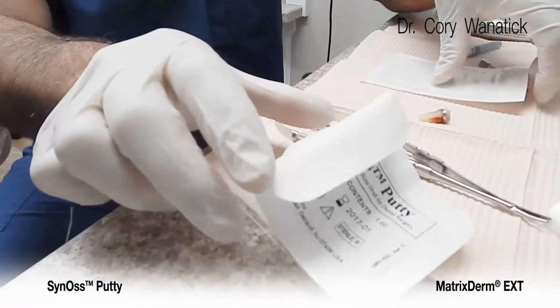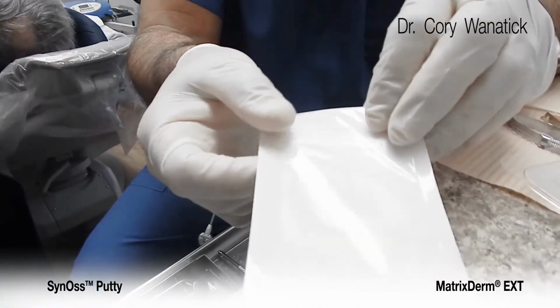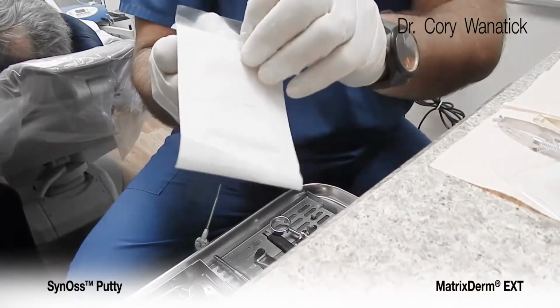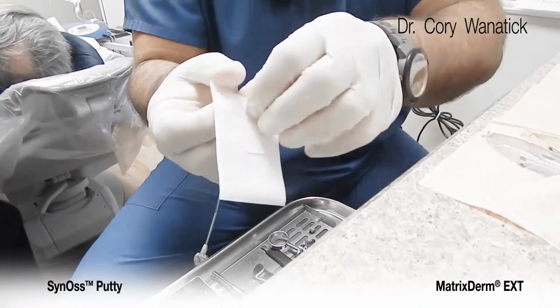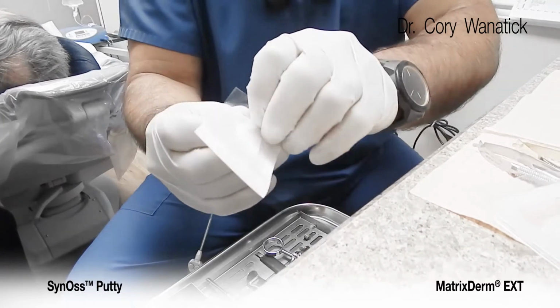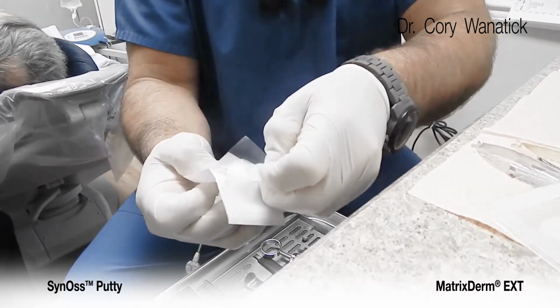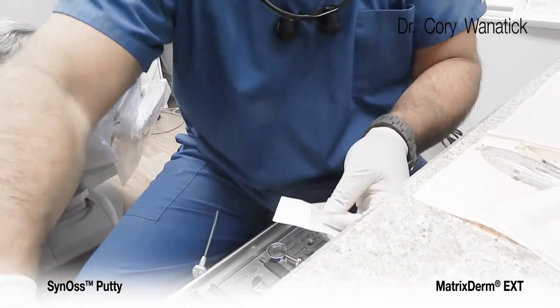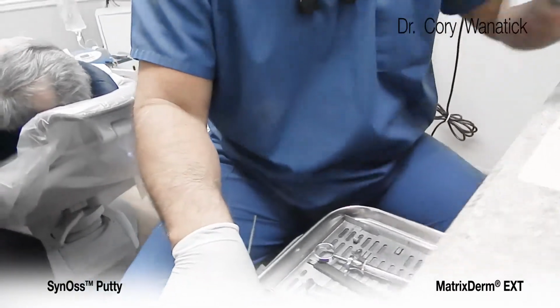We'll take out the porcine collagen membrane, open it, and let it soak also in saline for approximately 1 minute or longer, just so there's some malleability and also retention of the rigidity. Take this out and we'll drop that into saline.